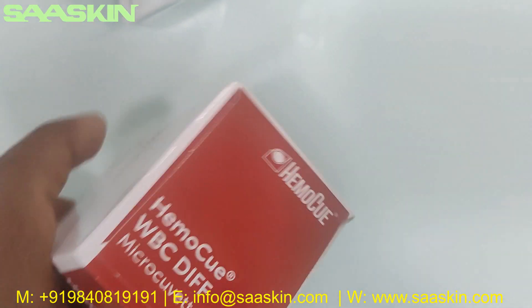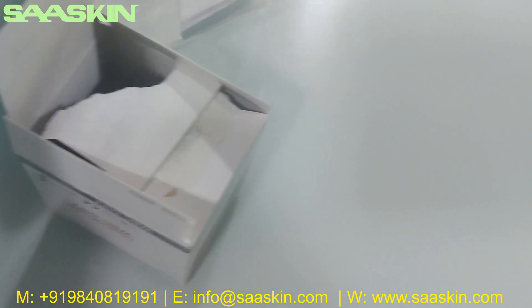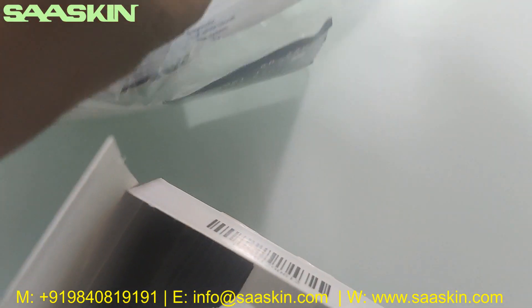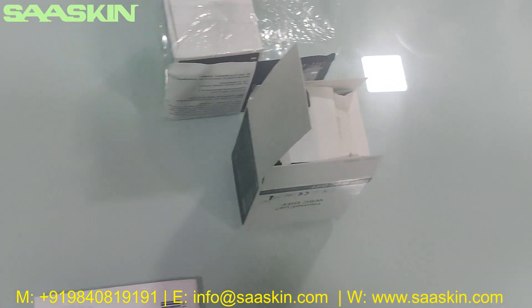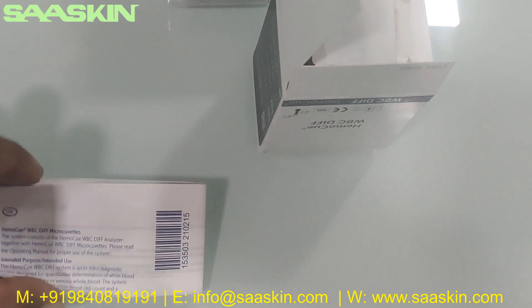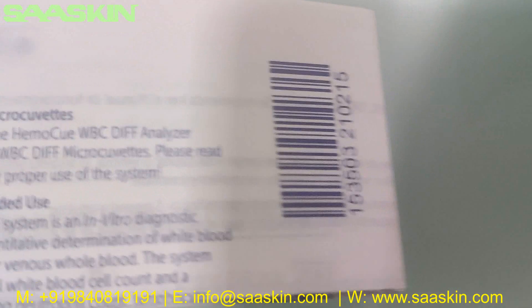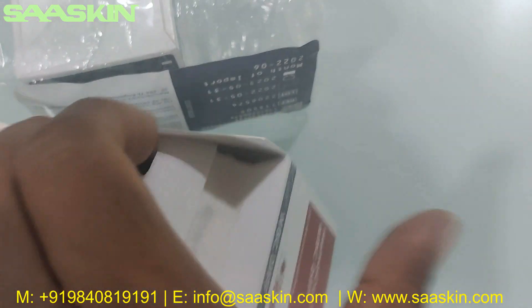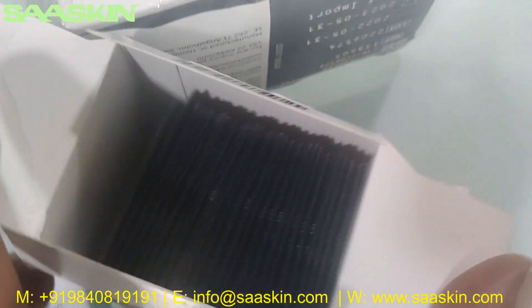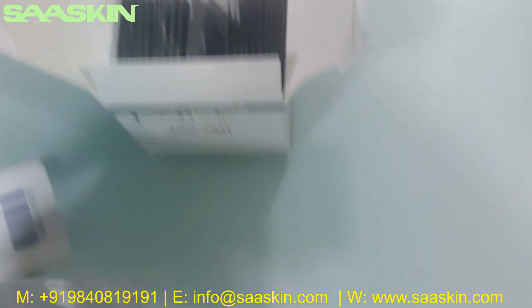Let me open this for you. Inside the kit, you also have one IFU brochure for every pack of 50. In each pack, you have two boxes which contain a total of 50 microcubets, and you get one IFU brochure. You can see the IFU brochure here for the microcubets. Inside the box, I am just opening one box — you can see there are 25 microcubets. Let me take two out.